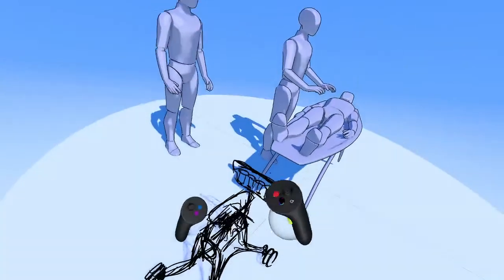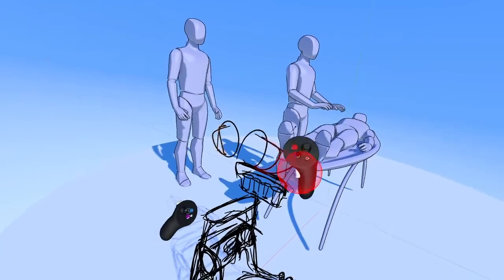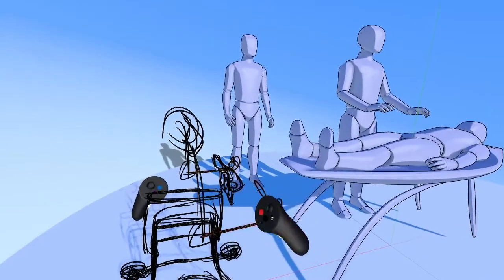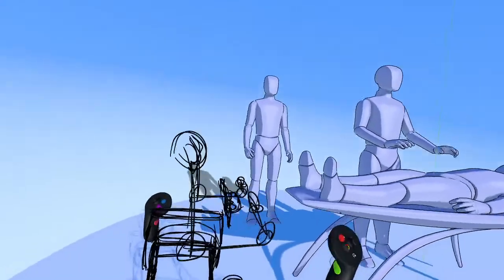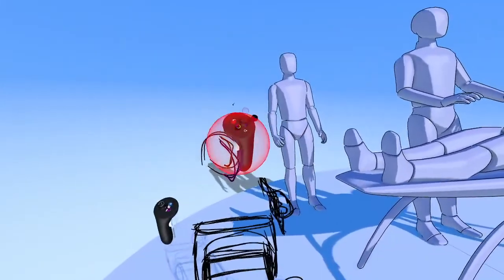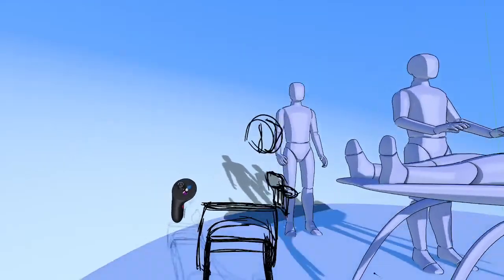And then of course we're going to need a spot for at minimum two arms here. So let's just loosely sketch it out like that. Probably have an elbow, and then a section where it actually connects these different bits, whether it be some surgical knife or some pliers, something like that. So let's think about the location for these shoulders. We could move it up like that.